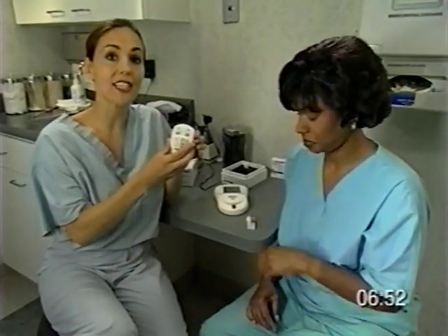Quality control testing is very important to make sure the monitor is working correctly and providing accurate results. The Coagucheck S system has an electronic quality control device and 2 levels of liquid controls. Your quality testing requirements will depend upon whether your facility performs CLIA waived testing or moderate complexity testing.